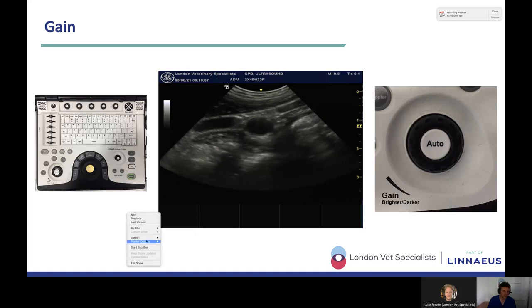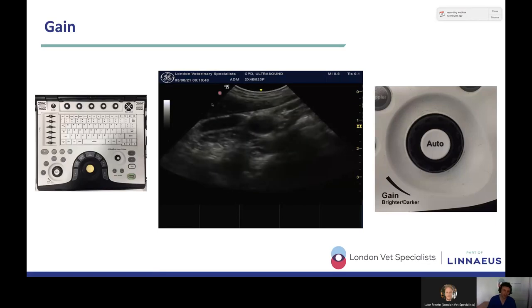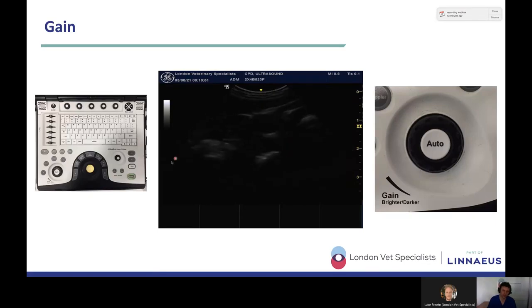So let's go back to my laser pointer for a second. This is our gain here. This is what it looks like, and this is what happens when we change the gain. So that's turning the gain all the way up. All of our sector is getting brighter, and all of our sector is getting darker as we toggle our overall gain. So let's do that again.